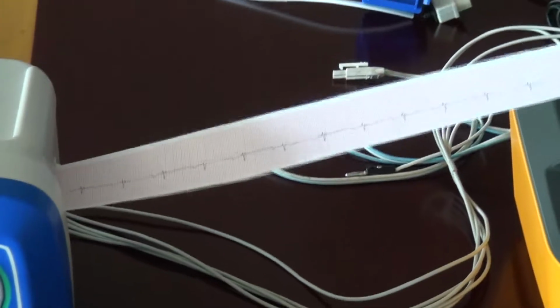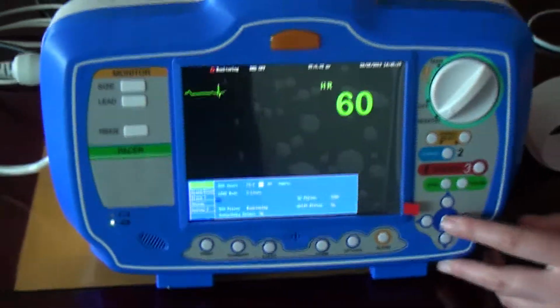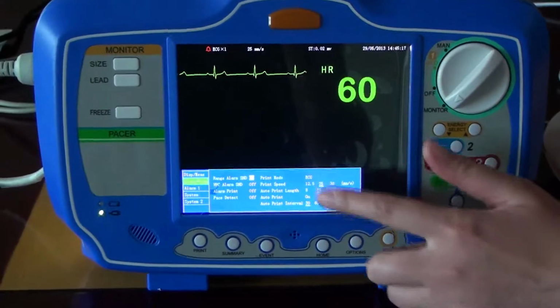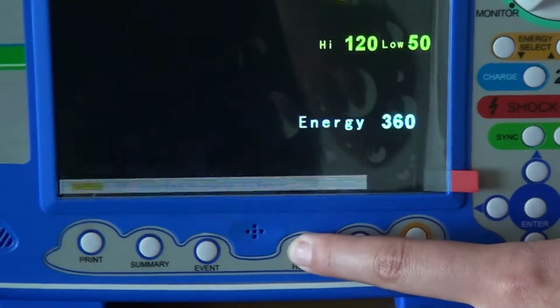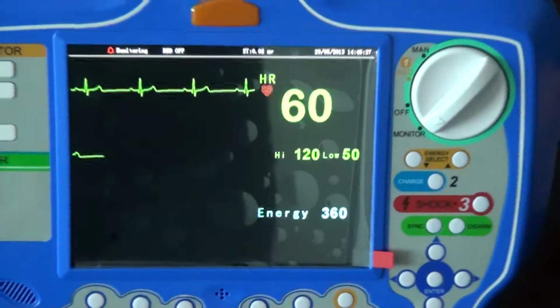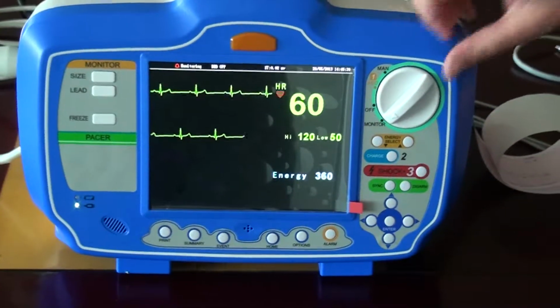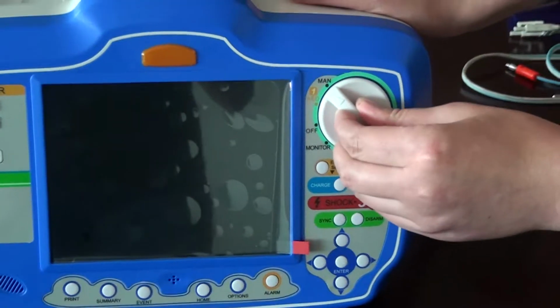For the print length and speed, you can enter settings. Alarm print to set the print. And press home to go back. For more information, please read our user manual. And this one is for the monitor model. Now we turn off and enter the menu.